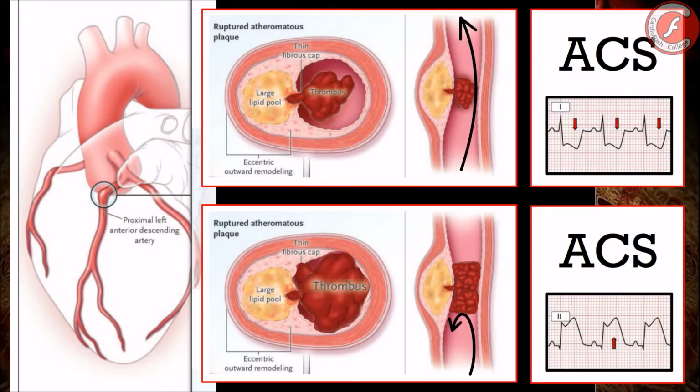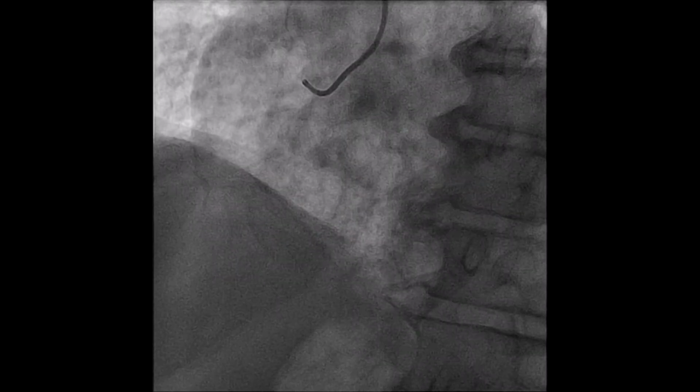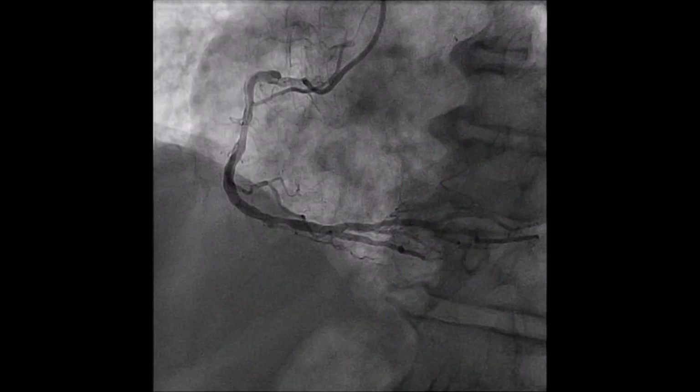Very simple. ST segment elevation myocardial infarction is the regular clinical manifestation of a complete blockage of a coronary artery and constitutes a cardiological emergency where every second counts. In this way, our main objective is to open the artery as soon as possible, whether using fibrinolysis or primary angioplasty. In this case, cardiac catheterization is made.